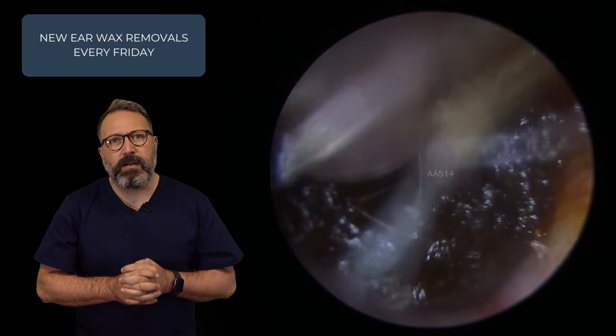My view is reversed when I look at these — my right is my left, so I find that a little bit hard. We're just taking a little bit more olive oil in. You can see how that olive oil makes such a big difference with this stickier type wax on the canal wall. That bit's gone — let's see now if we can draw this next section down. Look how all of that is starting to pull into the suction machine. You can see the olive oil pooled down the side as well, which means if we do manage to get a really good grip on maybe a slightly harder nugget of wax in the middle of that softer section, it's going to pull the whole thing. See how that all has now leapt forwards — we've got it right to the entrance of the ear canal.